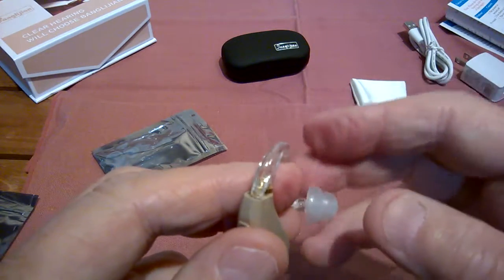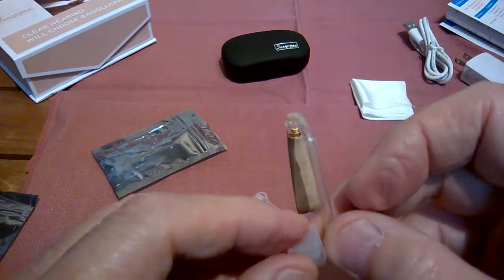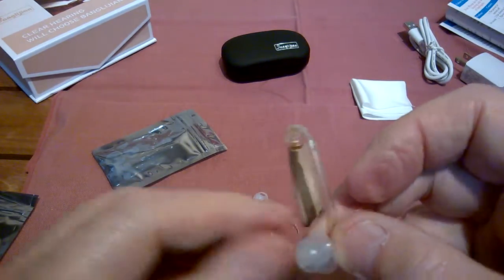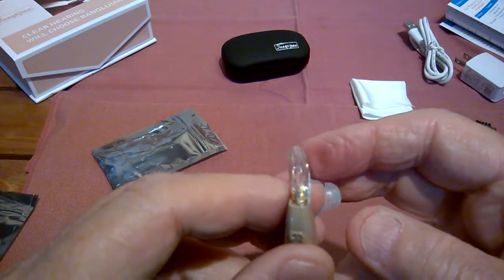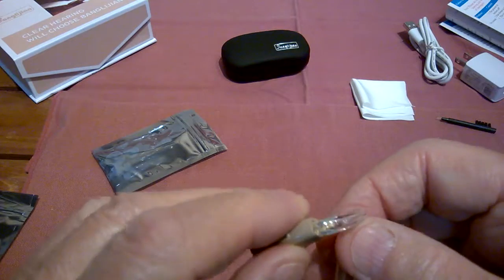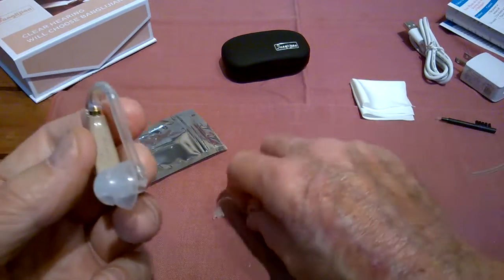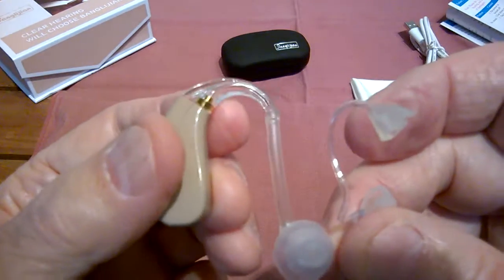This makes it a little bit louder. This is sort of easier to seat in your ear. Easier to take out, put in. But it does increase the volume. So it's just a matter of choice. I would suggest you try it different ways and see what you like. This is more visible because it's a bigger tube. The smaller tube is a lot harder to see when it's in your ear.